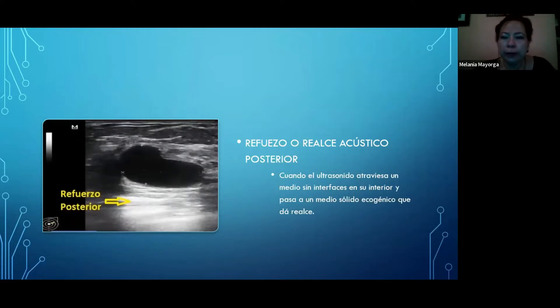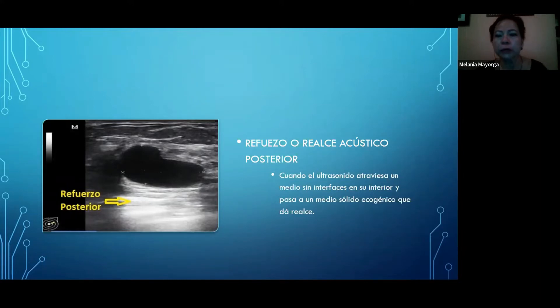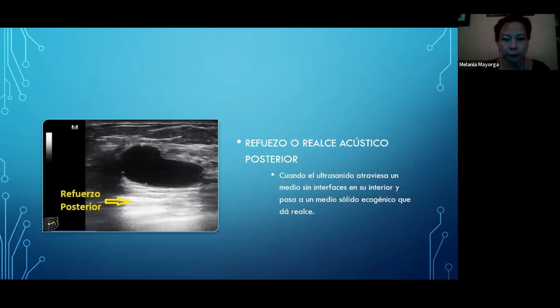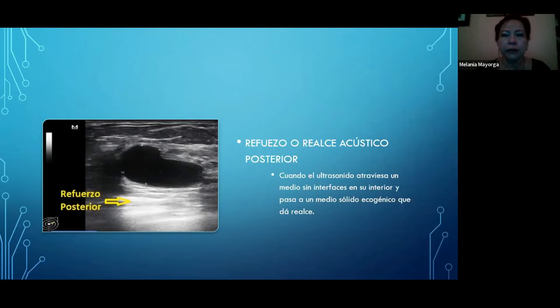El refuerzo o realce acústico posterior nos es de mucha ayuda, definitivamente, porque nos va a servir para decirnos qué contenido tiene la lesión que estamos viendo. Cuando el ultrasonido atraviesa un medio sin interfase en su interior y pasa a un medio sólido ecogénico, queda el realce. Nos vamos a dar cuenta de que estamos viendo un contenido claro que nos está dejando pasar el sonido libremente, y el refuerzo posterior nos va a servir de diagnóstico.